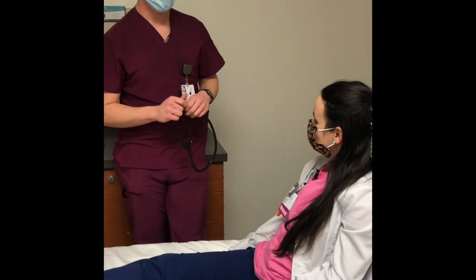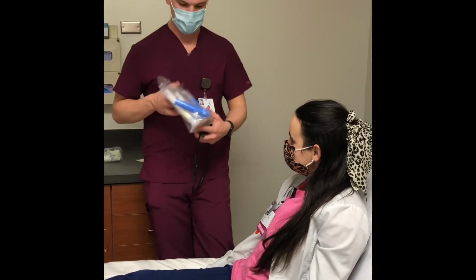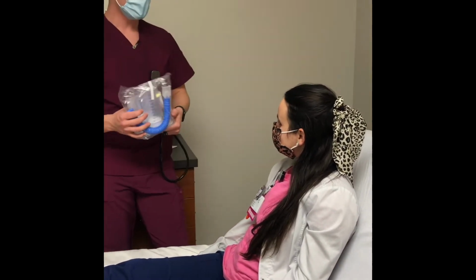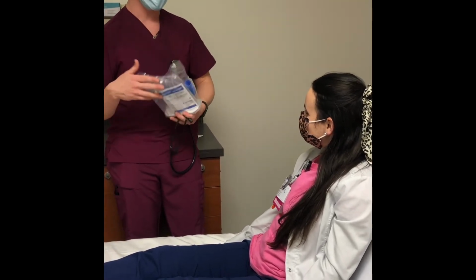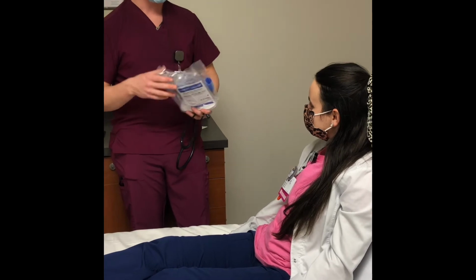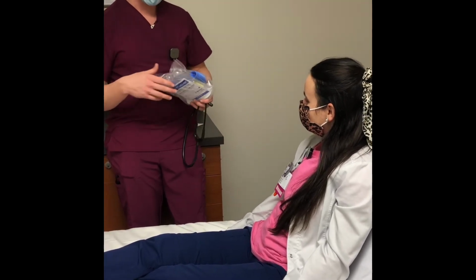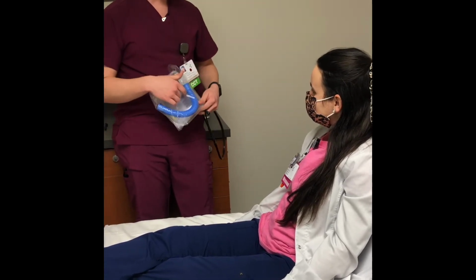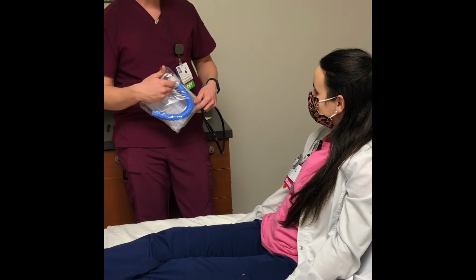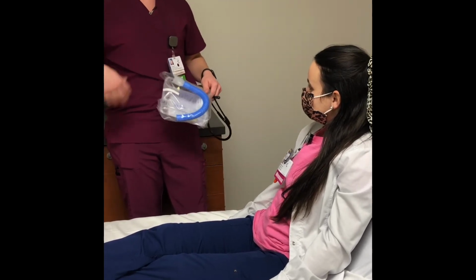So that's good. One thing that I'm going to ask you to do is use this device. It's called an incentive spirometer. What you're going to do is inhale as much as you can for as long as you can, and then you're going to hold it. Okay. And you're going to hold it until you just feel like you can't hold it anymore. Then you're going to let all the air out. Okay. We're going to set a goal for you, and of course the goal is to meet that goal, and that is just going to expel any mucus that you have resting in your lungs and stuff like that.